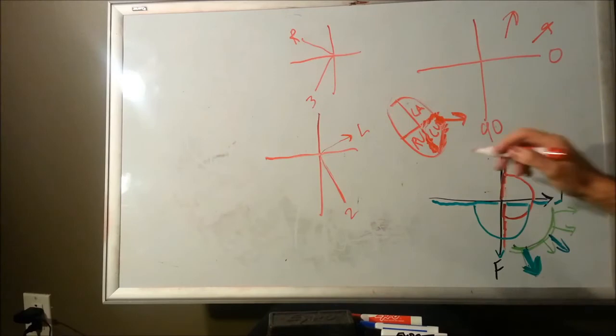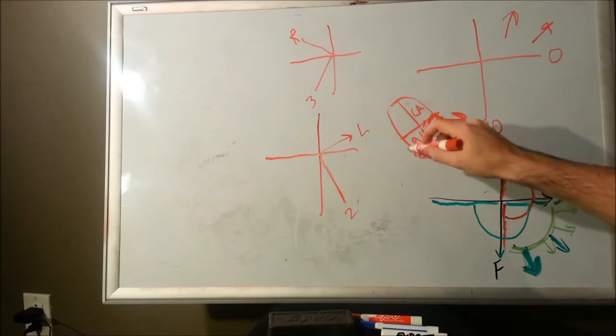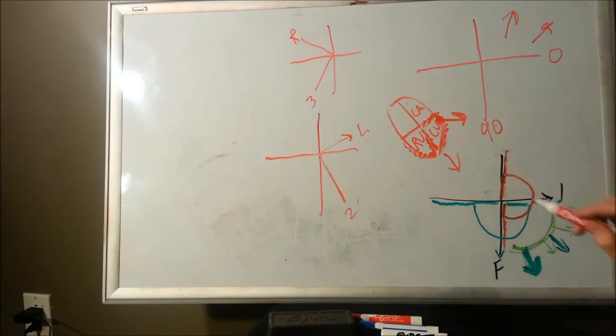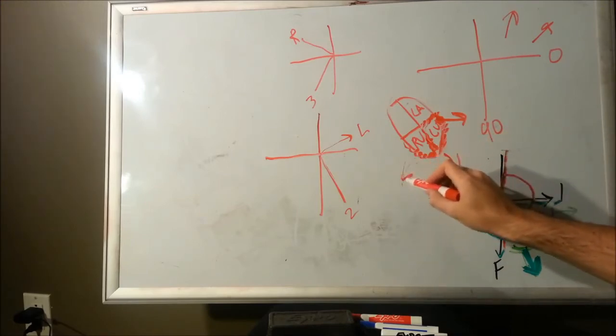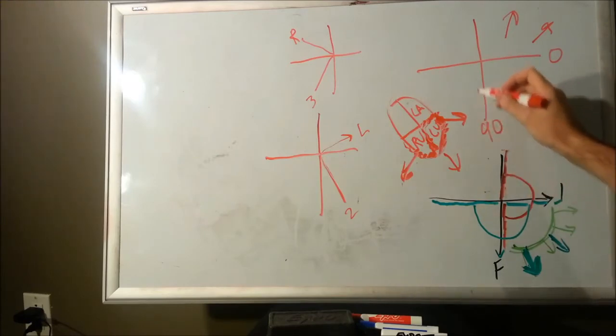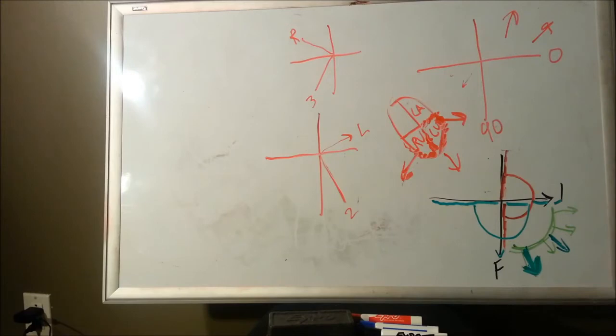that's going to be considered a left axis shift. Likewise, if your right ventricle hypertrophies and it brings your mean axis, and normally you're at about a 45, if it brings your mean axis vector force down above 90, so somewhere over here or over here, that's going to be called a right axis shift. Typically, anything between 0 and 90 or about there is going to be a normal healthy heart.